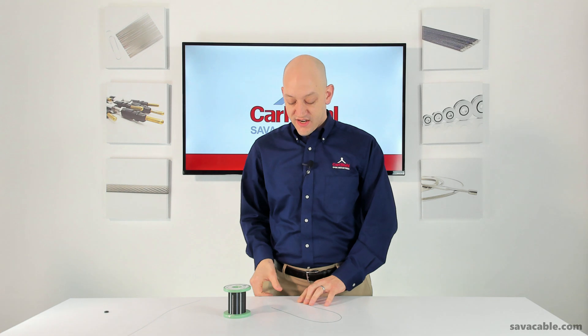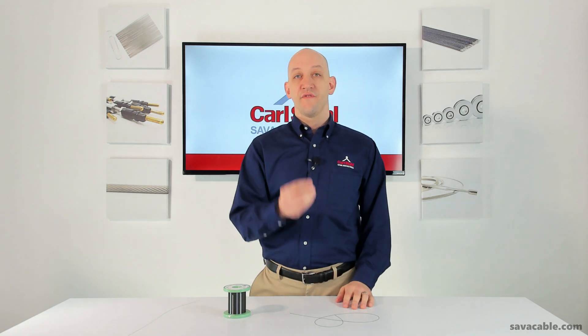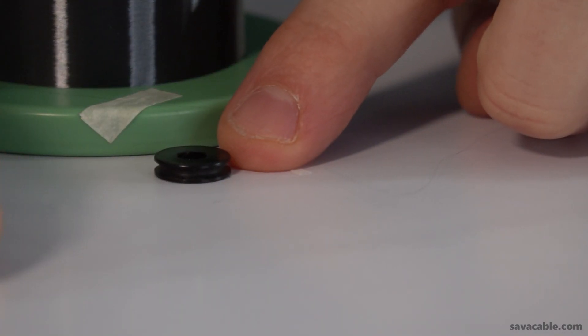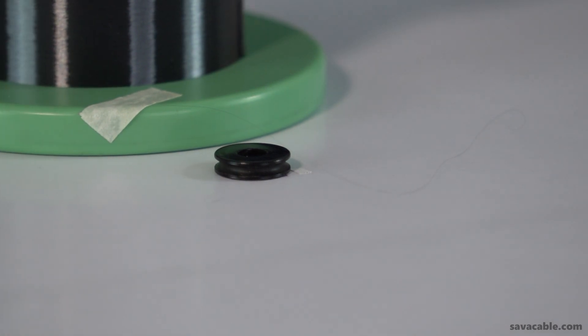A great advantage to this ultra-flexible cable is that it can go over pulleys as small as two millimeters in diameter, which is very common in a surgical robot. Let me put that in perspective for you. I have here a very small pulley, something that's about the size of my fingernail. You could fit four two-millimeter pulleys just inside that center hole and still have some room left over.